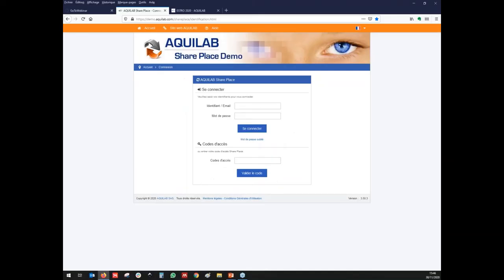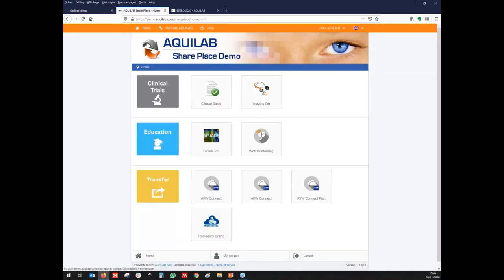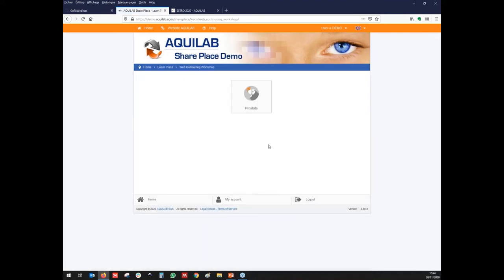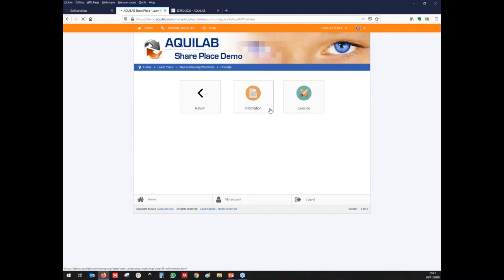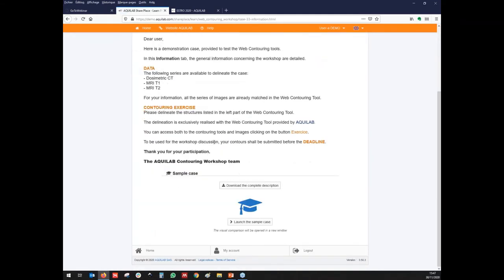To show you how it works, we connect to our platform. Each user has a personal login and password and can access different projects. I will go here into the web contouring workshop. In the information section, we can give some details about the exercise.